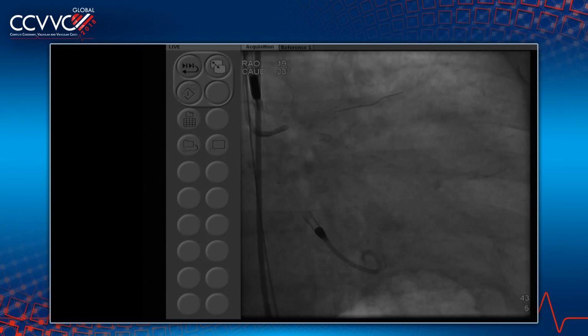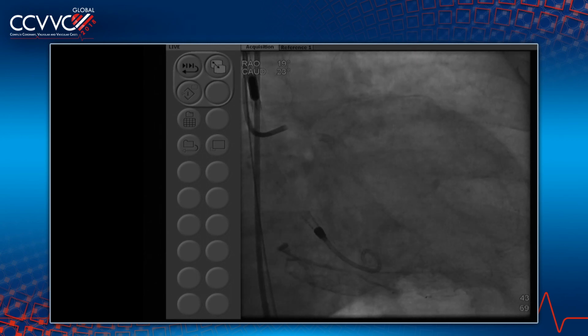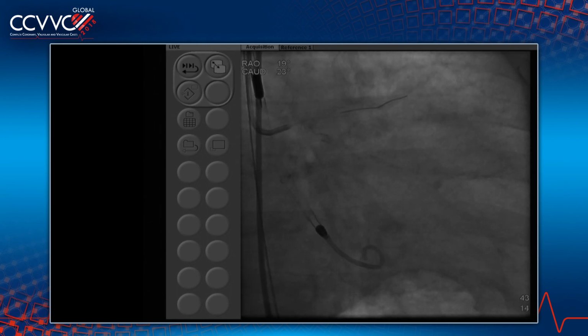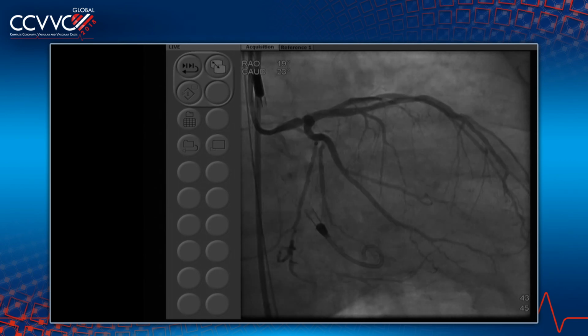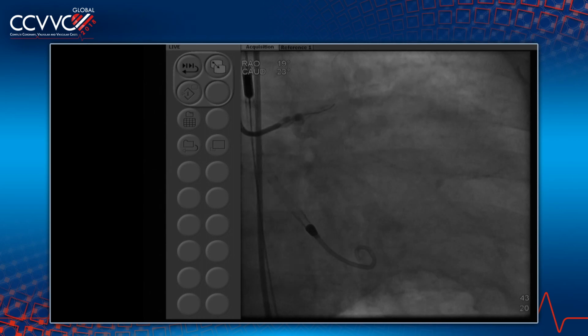Yeah, so let's give her a rest, or him a rest, 67 years old, and you'll tell us maybe how the right goes. Maybe you'll do that as a live case, Dr. Kini. Thank you. Okay, thank you so much.